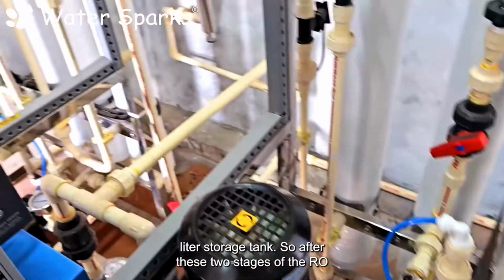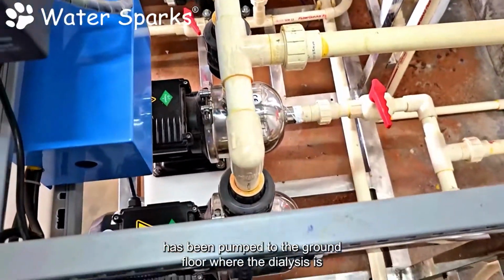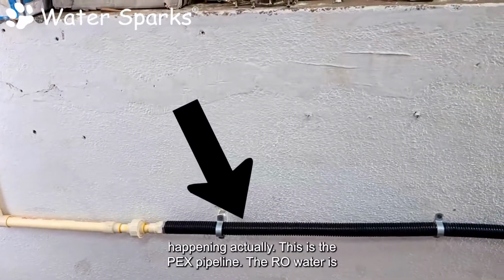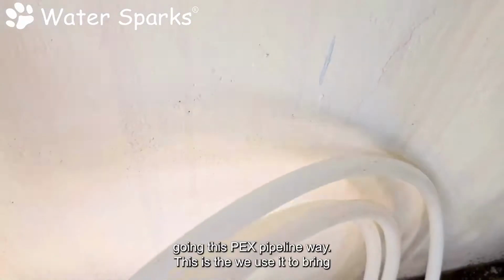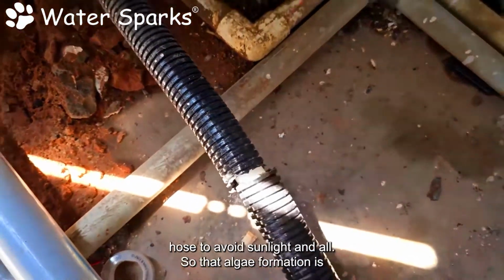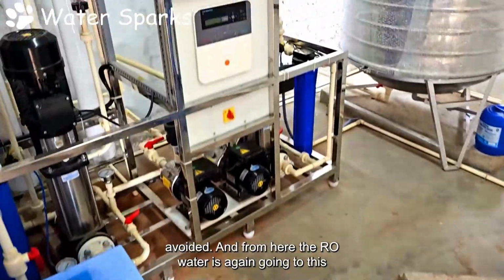So after these 2 stages of the RO process, you can see down here these 2 motors. From here, it is pumped to the ground floor, where the dialysis is actually happening. This is the PEX pipeline. The RO water is going this way through the PEX pipeline. This is the PEX pipe. We use it to bring the RO water. We covered this pipeline with a black hose to avoid sunlight and all, so that algae formation is avoided.